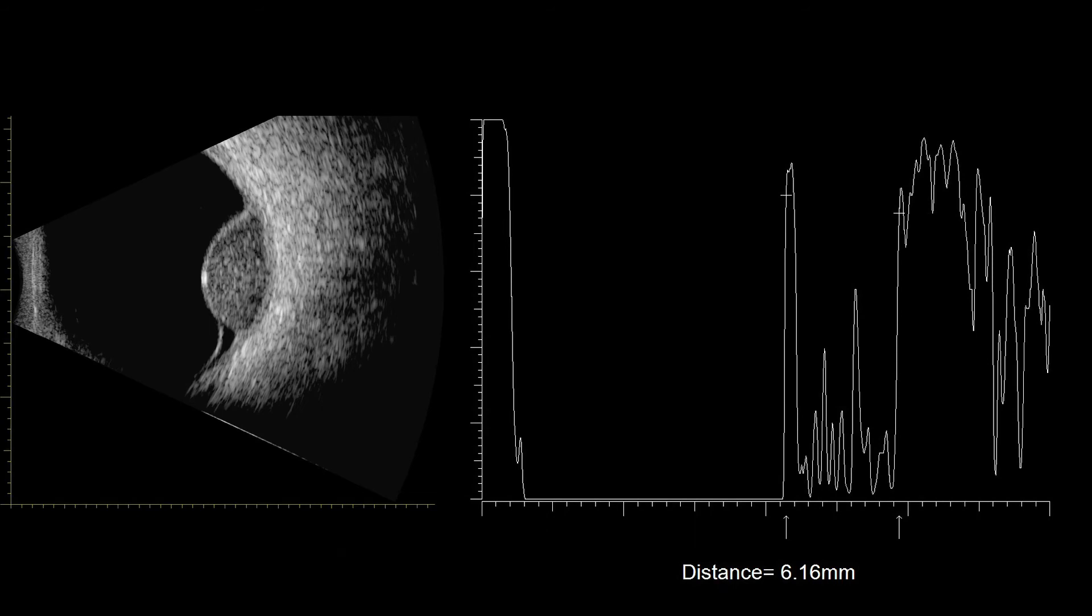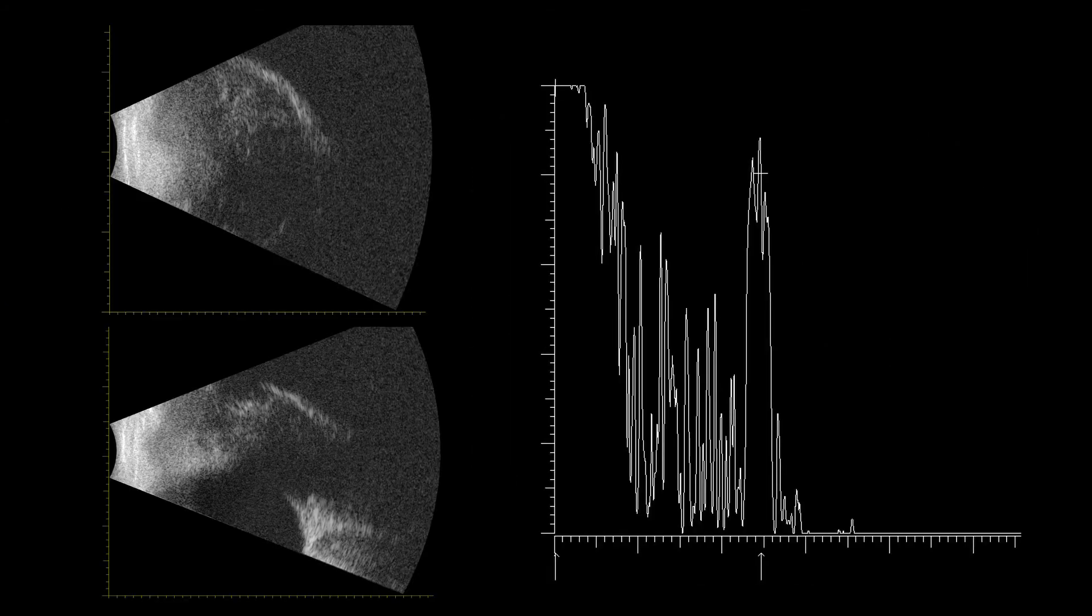The A-scan echogram represents amplitude of sound reflection with reference to time. Because the rates of ultrasound propagation are known for ocular media, precise dimensions of intraocular structures can be obtained from standardized A-scan.